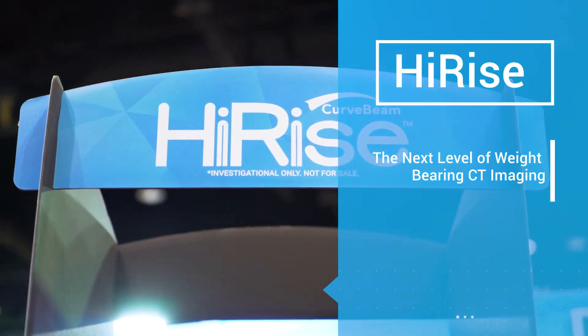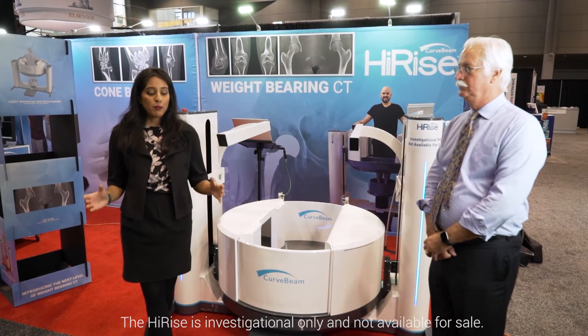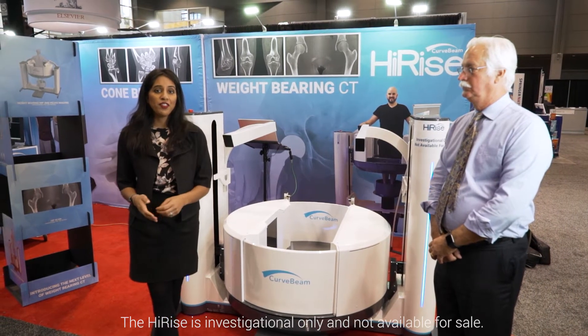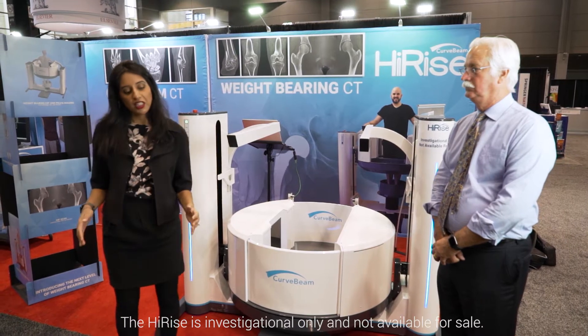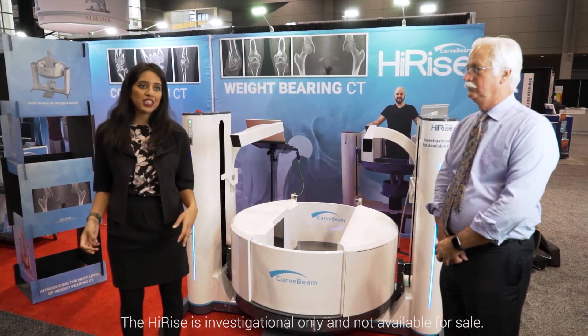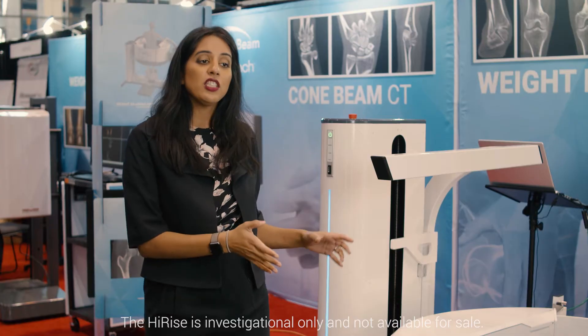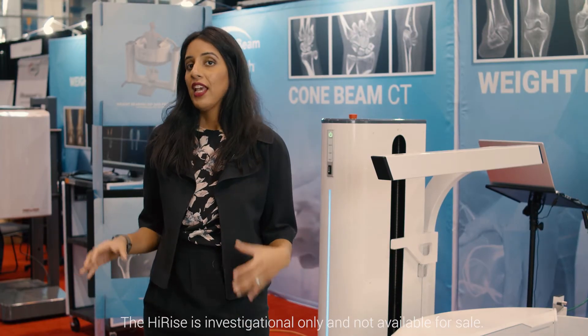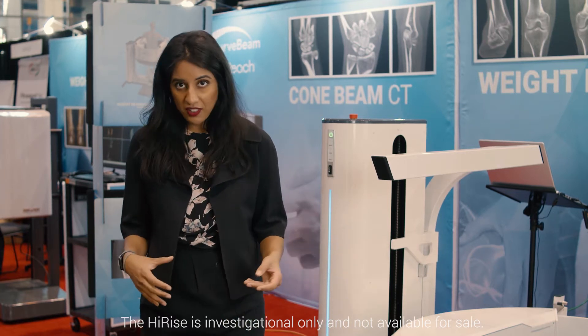Curve Beam systems have the largest patient platform in their class. The patient platform has a diameter of 35 centimeters — that's enough space for the patient to stand with both feet naturally side by side. We've also designed our system so it's very easy for the patient to walk in and walk out, and also easy for the technologist to assist them into and out of the system.